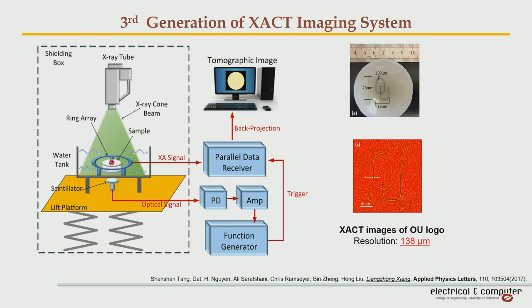That's a demonstration, again, with high-density materials. We improved the resolution to around 100 micrometers with a 5 megahertz center frequency transducer array.